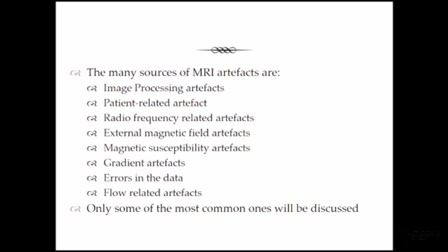And again, that's not necessarily something that we can fix as radiographers, but it may mean that we need to have a service call. Probably the other one that you see a lot is the lights. The lights that go in MR rooms, you tend to not want them to be incandescent light globes, because when they blow while you're scanning, you get a big artifact. They'll put a zipper artifact right through the middle of the image. So they tend to use other sorts of lighting, if you can, more DC than AC related, so more sort of lower voltage DC lighting rather than 240 AC.